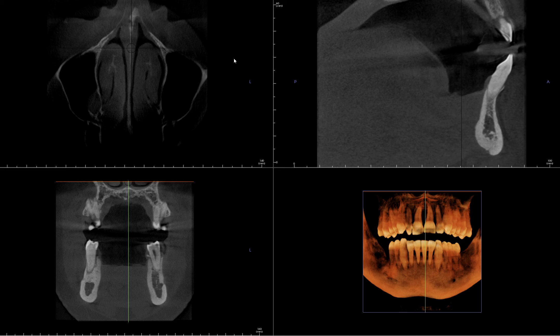Hi everyone! For this CBCT scan, I want you to determine where the primary area of concern is.